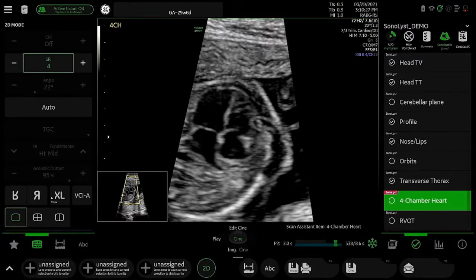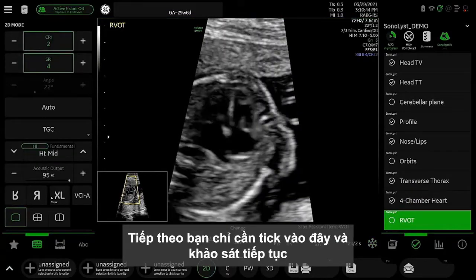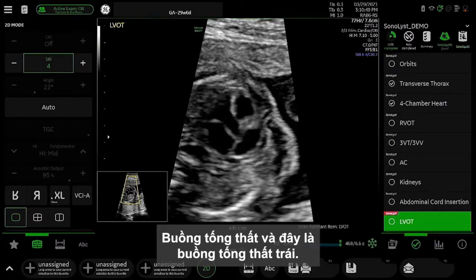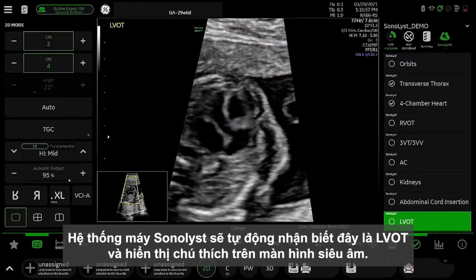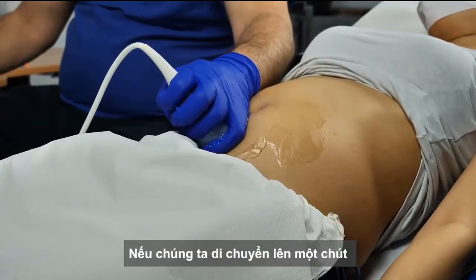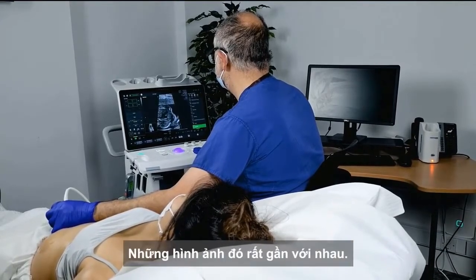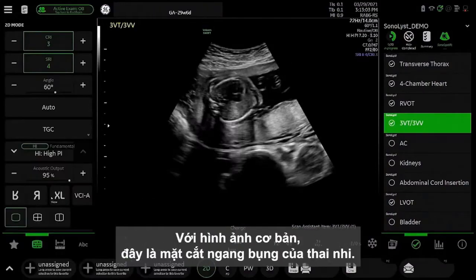Good. Click there, and then it's telling me to look for the ventricular outflow tract. So this is actually the left ventricular outflow tract. Let's see, yes, and you can see LVOT there as it's recognizing that. As we move up very slightly, you come to the right ventricular outflow tract and the three-vessel view. Those views are very close to each other. You come back to the standard view.